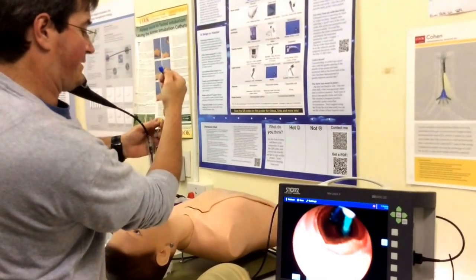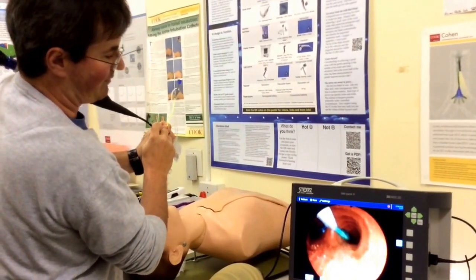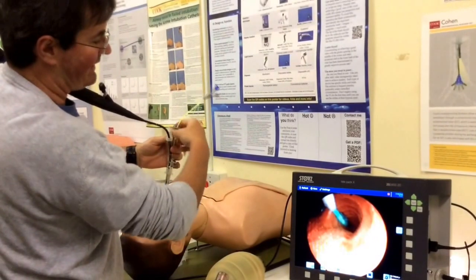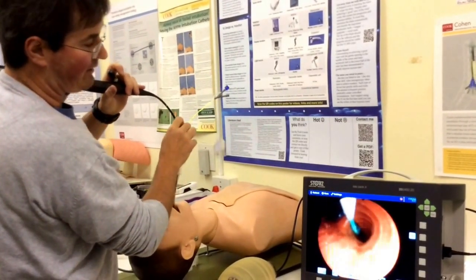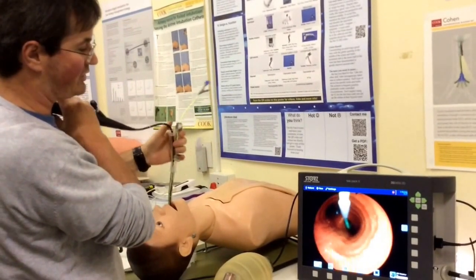There we go — now I've got it sitting nicely. That actually showed us one significant problem you can encounter. Now I've got it sitting at the carina and I can turn the lock to hold the bronchial blocker in place at the carina. Now I can take the scope out, move the patient, roll them into a lateral position, and get ready for surgery.